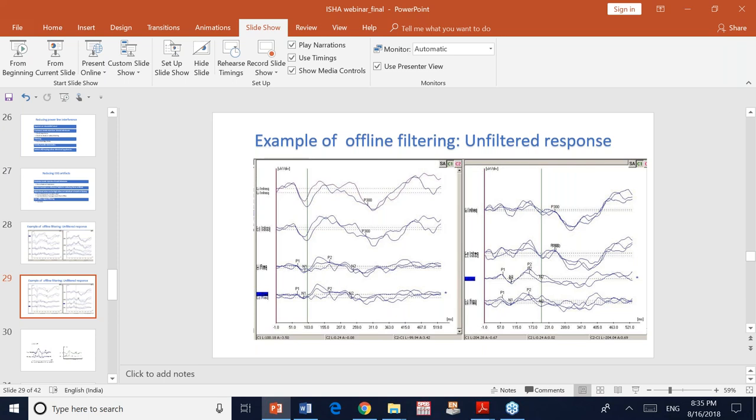So people in the coastal region are probably likely to have more problems if they don't have an AC room. Again, it depends. If the person is already adjusted to that and is not really sweating that much. But sweat can induce skin potentials.